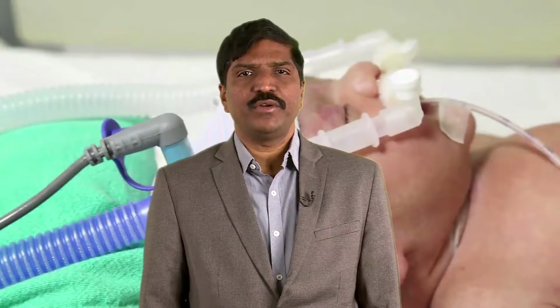Ensure the prongs fit snugly into the nares. Watch for symmetry of the nose, blanching of the skin and any skin breakdown. Ensure distance between the columella and nasal prongs. The cap should cover the ears and fit snugly.